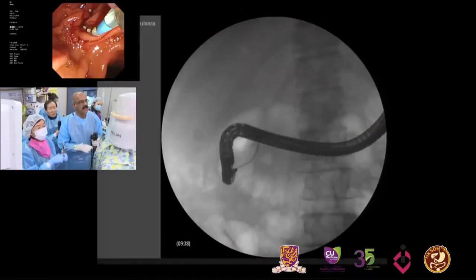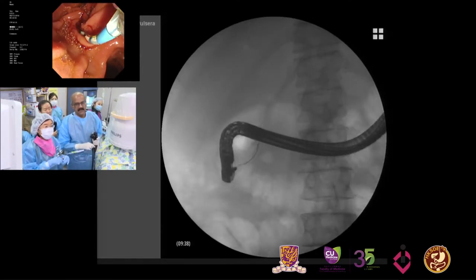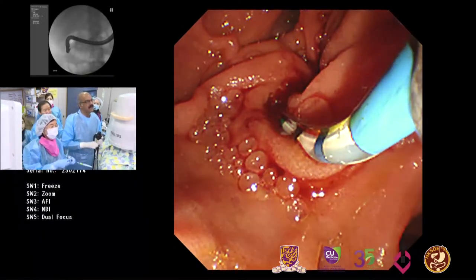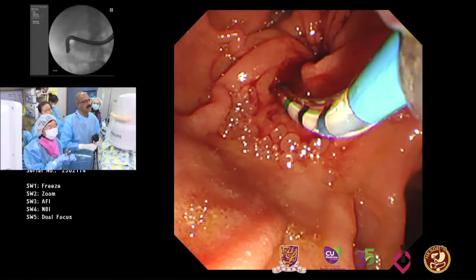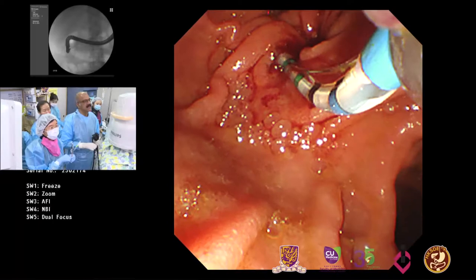I'm trying to do a wire-guided cannulation. If there's resistance, you tell me. Resistance, okay. Then I just have to go a little more to the top there. Can you flex the sphincterotome? Can you bend it a little? So I'm bending. This has a ball tip. It's got a very rounded tip, the Omnitome, so it's safe in the sense that the incidence of pancreatitis is much less with this. Can you now?